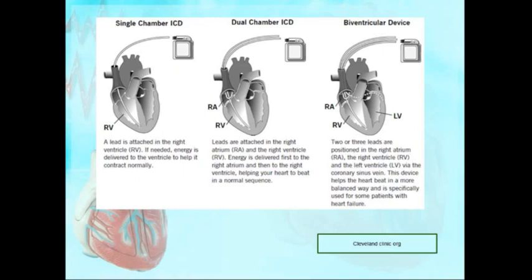The reason I tell you guys all this is that many times patients will ask you this question, when the cardiologist did not spend enough time, however they want to say it. We explain all this, and then they turn around and call internal medicine: tell me a little bit about this, where is my wire sitting? In spite of so much education, patients always miss something or don't understand something, so it's good for you to have some basic concepts of pacemakers and ICDs, okay?